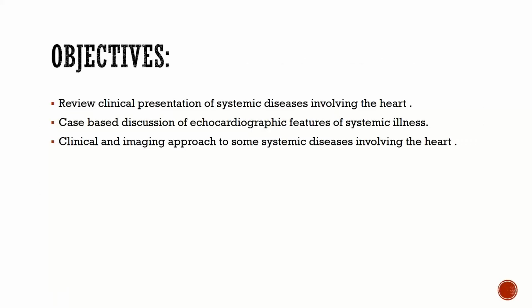Good morning, everyone. Today I will speak about echocardiographic features of systemic illnesses. My objectives will be to review the clinical presentation of systemic diseases involving the heart. Actually, a case-based discussion of echocardiographic features of systemic illness. We'll have some clinical and some imaging approach to some systemic diseases involving the heart.